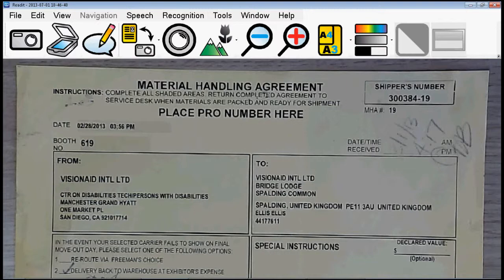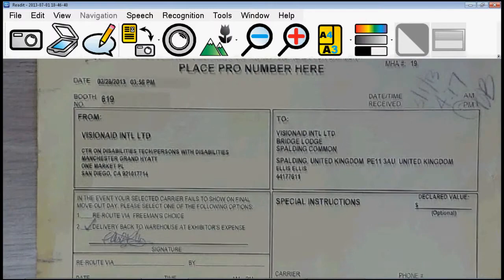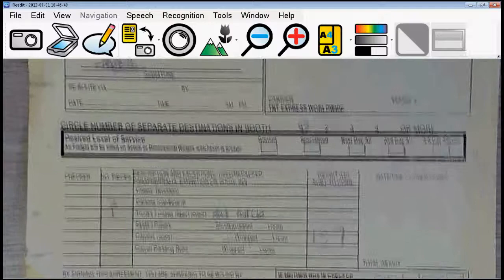Now I want to show the live image quality of the Scholar HD. I've got a document here — it's actually from the CSUN exhibition we do every year in San Diego. It's one of the material handling agreements from our stand. The reason I picked this document is it's actually a carbon copy, with some handwritten text on there, which is normally very, very difficult for CCTV systems to pick up, especially in two-colour modes. The performance may not be quite as smooth on the video recording because it's using up some processing power on the laptop.